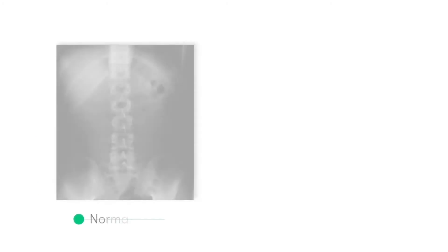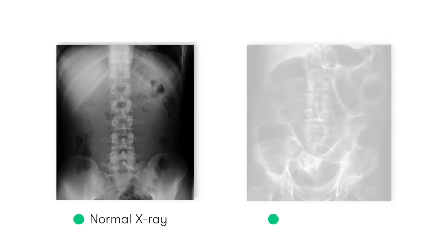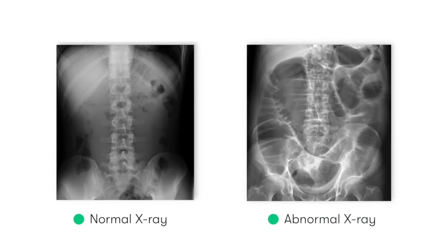Here you can see a normal abdominal X-ray, and next to it an abdominal X-ray that shows large bowel dilatation in keeping with the presence of a large bowel obstruction. I'm sure you'll agree it's pretty clear to see that there's an obvious difference between the two.